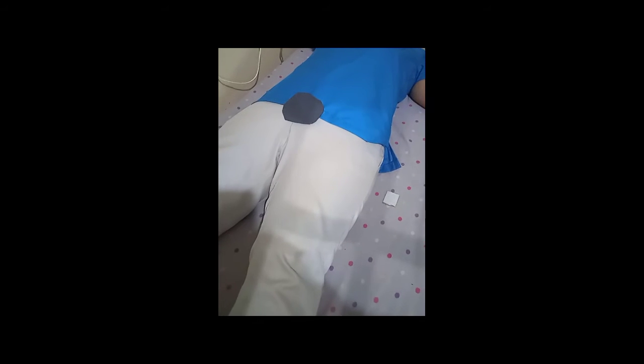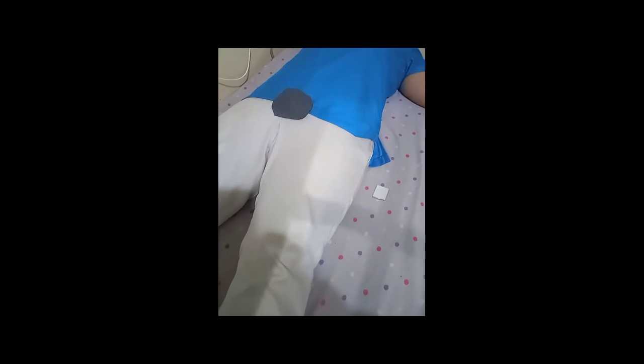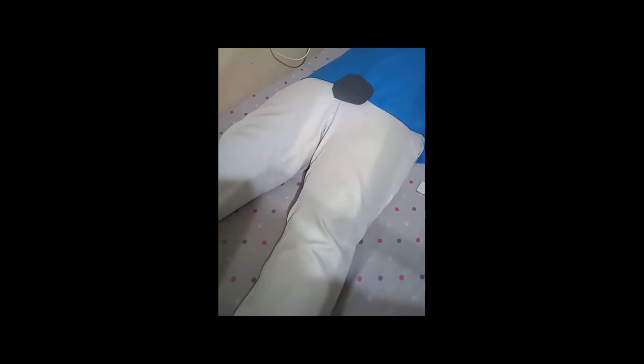For the collimation, make sure to include only the anatomy of interest. So make sure to collimate on the four sides of the anatomic part, and make sure that the knee joint and femoral joint should be included on the light field. So we will now collimate the anatomy of interest.